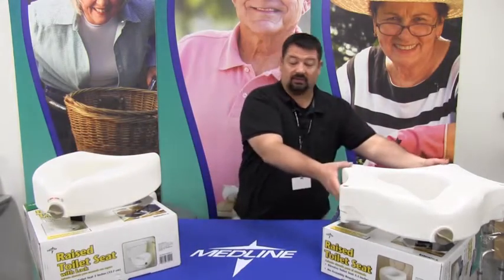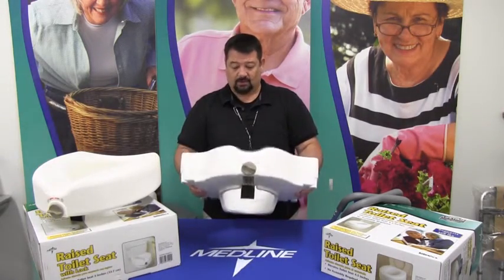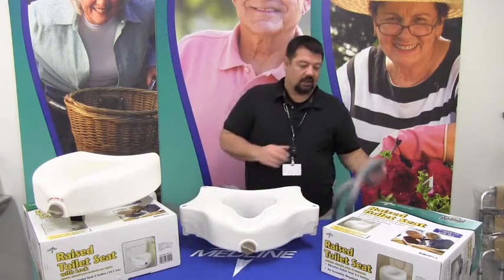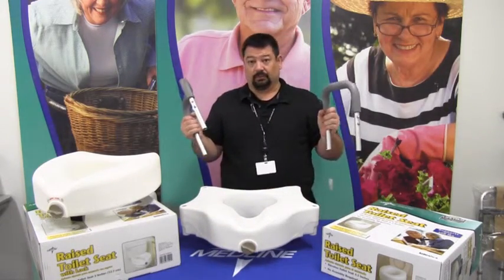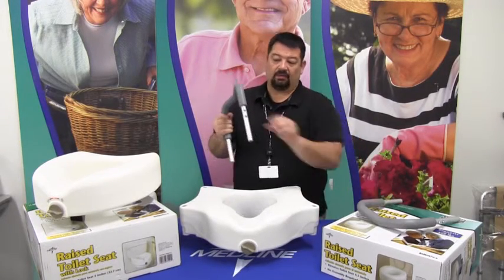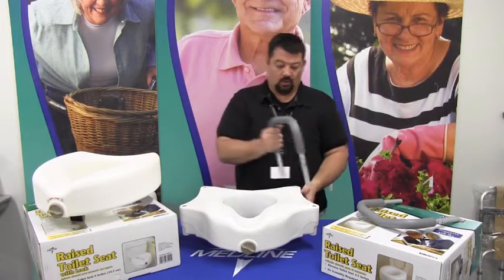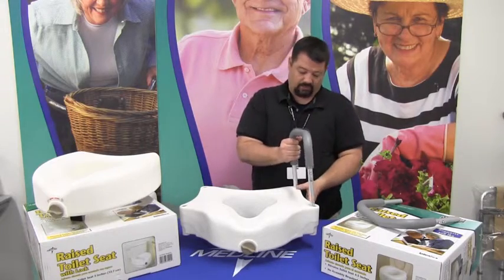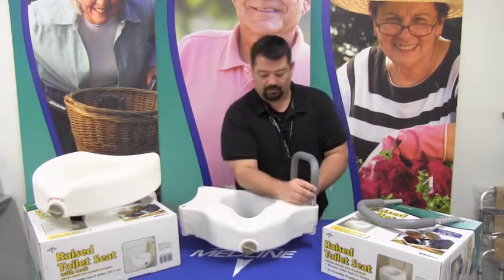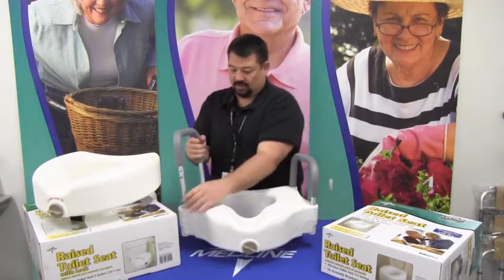The next one is going to be the same style with arms. It attaches the same way — up against the back of the commode, letting it fall forward, twisting it to lock it in place. Except now we have the addition of arms. The arms, as you can see, are chevron shaped and they have a push button lock so that you can put them on and take them off. When you assemble these, the push buttons are always going to go away from the commode. Set it in, push the button in, and they lock into place — same thing on both sides.